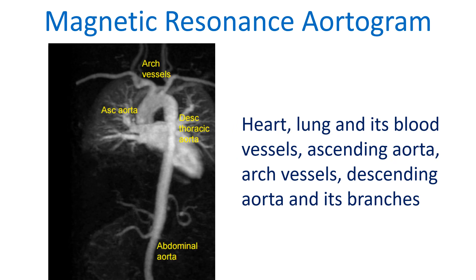This image shows the heart, lungs and their blood vessels, ascending aorta, arch vessels, descending aorta and its branches. Major visceral branches arise from the descending aorta.